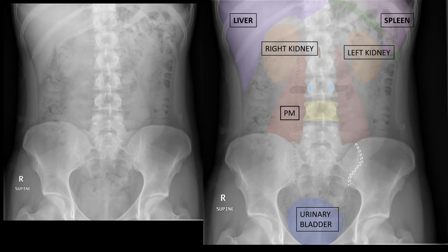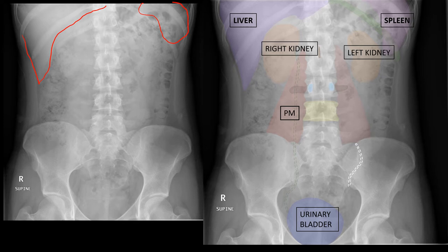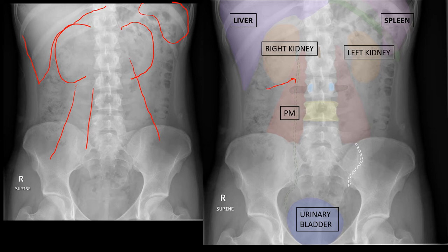In this image, we will try to identify various organs and structures. Organs give a shadow in the abdominal X-ray. Here we can identify the lower border of the liver in the right upper quadrant of the X-ray. This shadow is of the right kidney, and this is the shadow of the left kidney. Generally, ureters are difficult to identify, so we have drawn a dotted line for the ureter. We can also see the shadow of the psoas muscle, and in the pelvic cavity, we can see the urinary bladder.